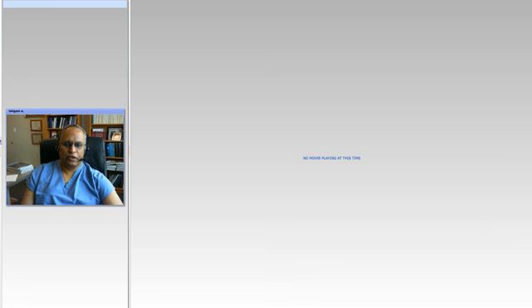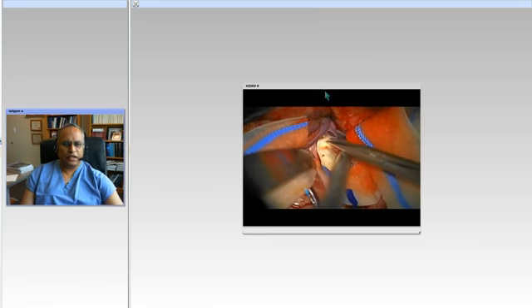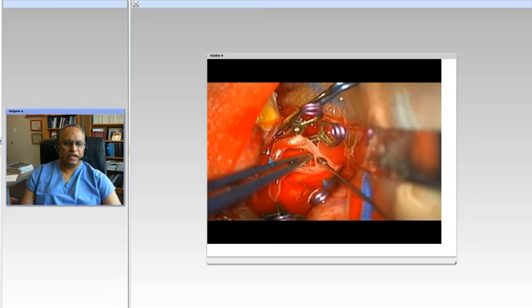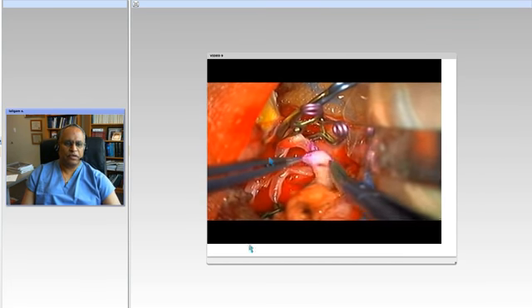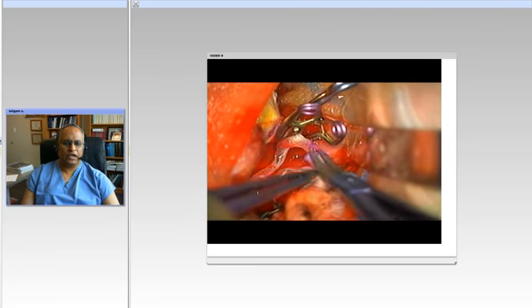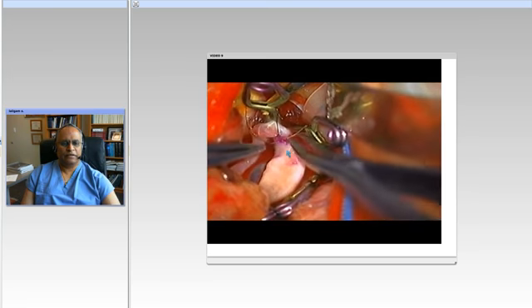So now we'll see the video. Again, I'll go through the video a little bit fast in places. You can see it at your leisure. Here's a very sclerotic aneurysm, left Sylvian fissure, which has been opened. So here we are suturing the radial artery graft to one M2. You see that there.